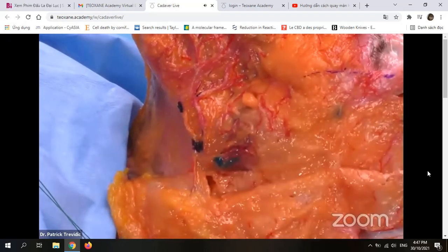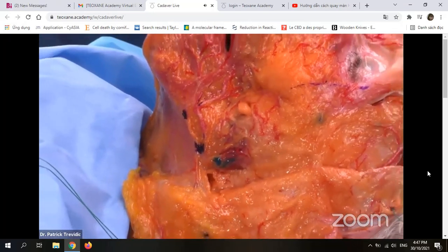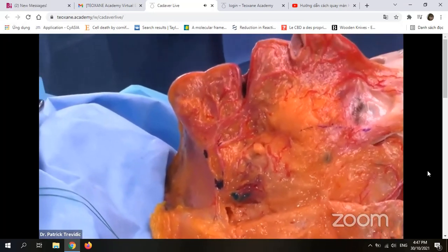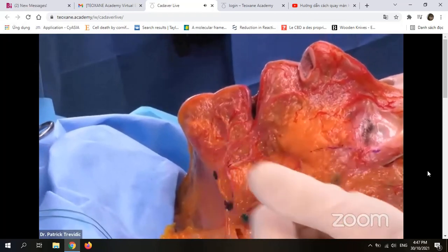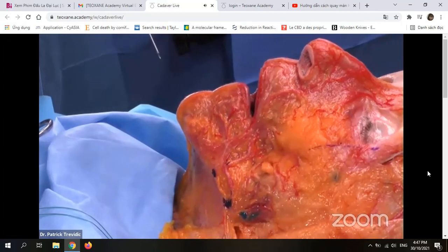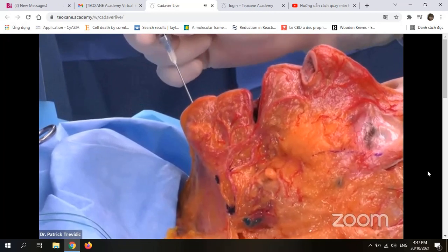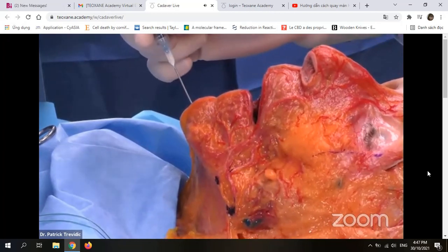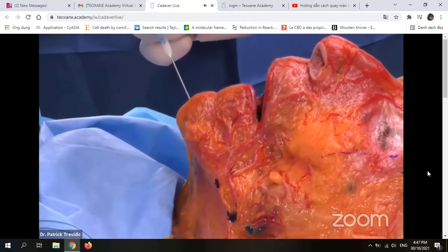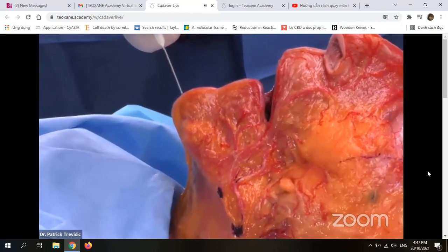So let's go now to the chin. So we de-zoom a little bit, and Nabila did a multi-layering technique, like here. So what she did is a direct bolus injection in the chin. So here, Sasha, could you push the plunger? If you push the plunger, you will see that the chin is lifting, as you can see here if you zoom.